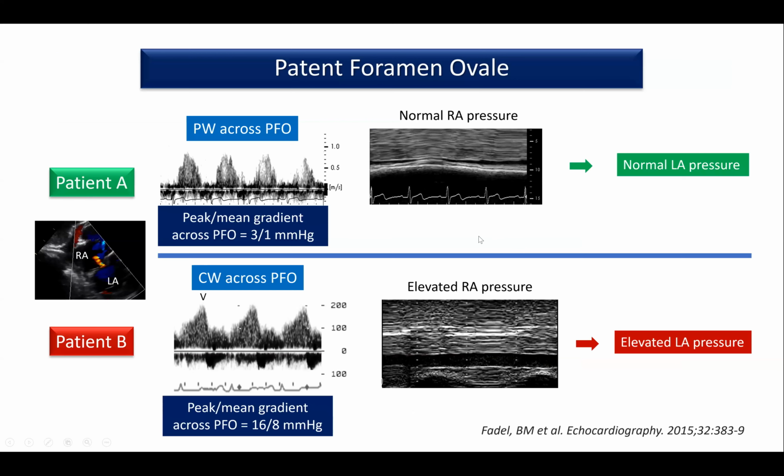Another pattern that is very, very important takes advantage of a patient who has a patent foramen ovale, from the subcostal window.